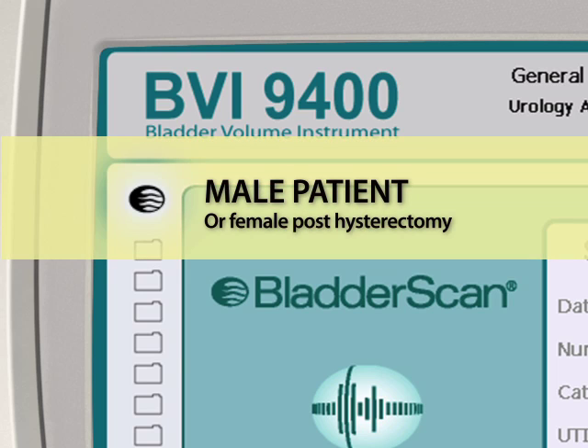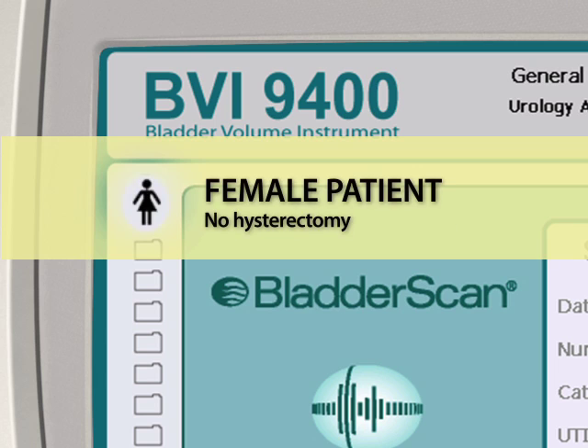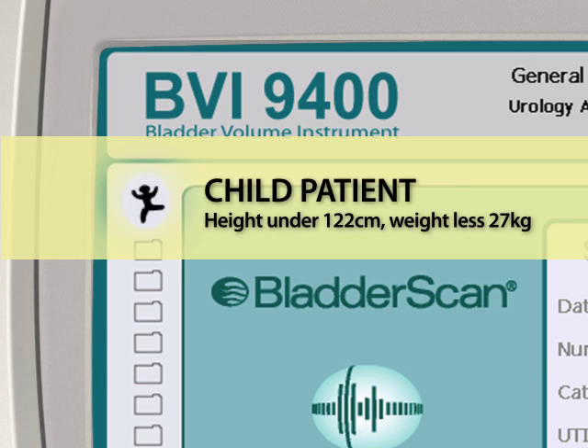Select to scan a male patient or a female patient who has had a hysterectomy. Select to scan a female patient who has not had a hysterectomy. Or, select to scan a small child under 48 inches tall (122 centimeters) and weighing less than 60 pounds.